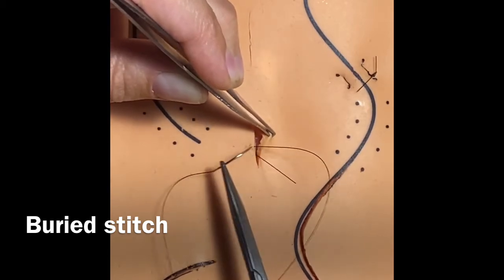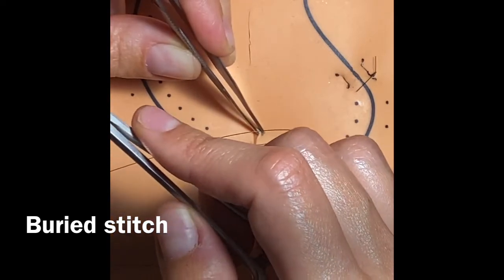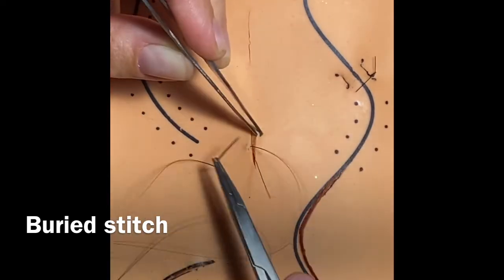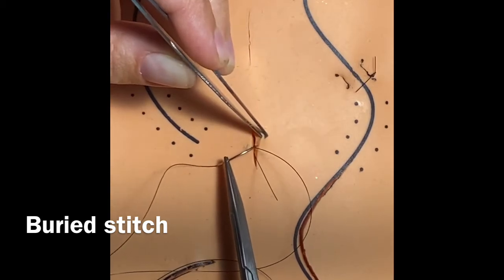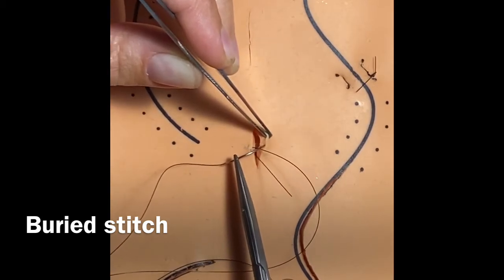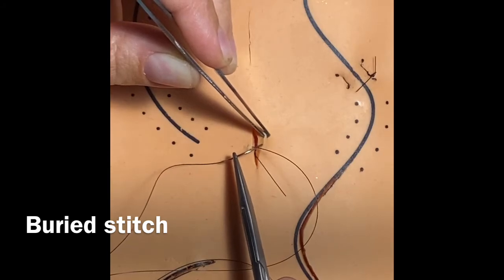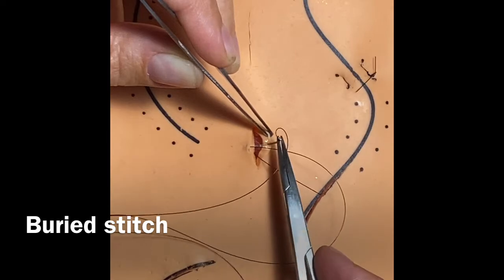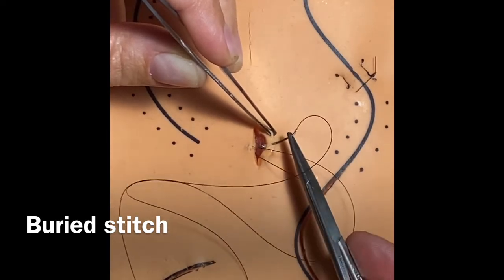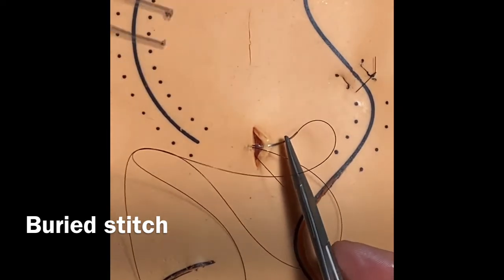So I'm going in, my hand is out of the needle driver holes, my fingers are out of the holes, and that gives me better mobility of my wrist to push this needle through. So I'm going into the skin edge, the epidermal dermal junction at about 90 degrees, turn my wrist, and then I'm going to come out in this deep layer here. Can you see that? Okay.